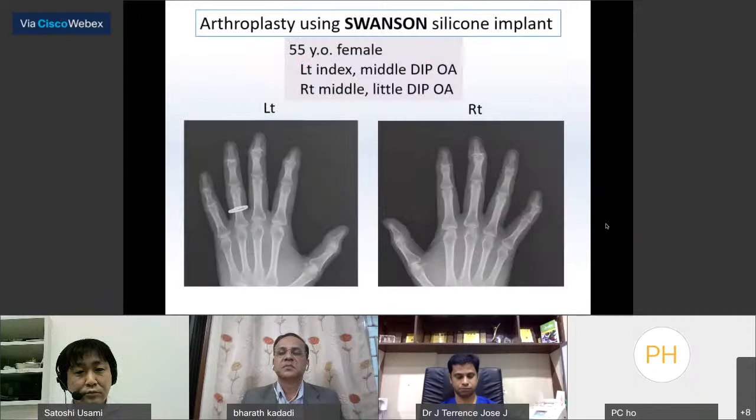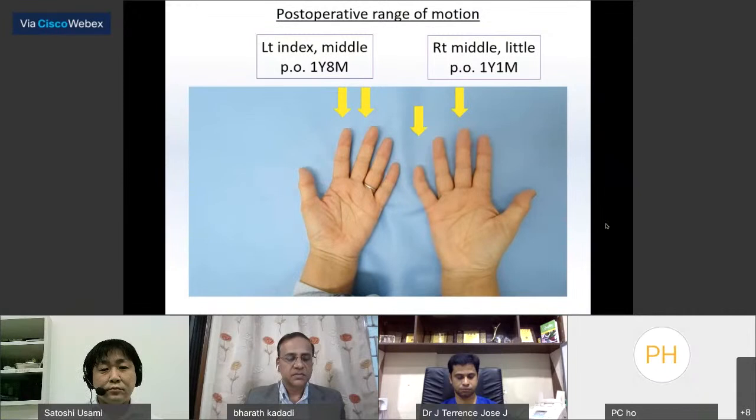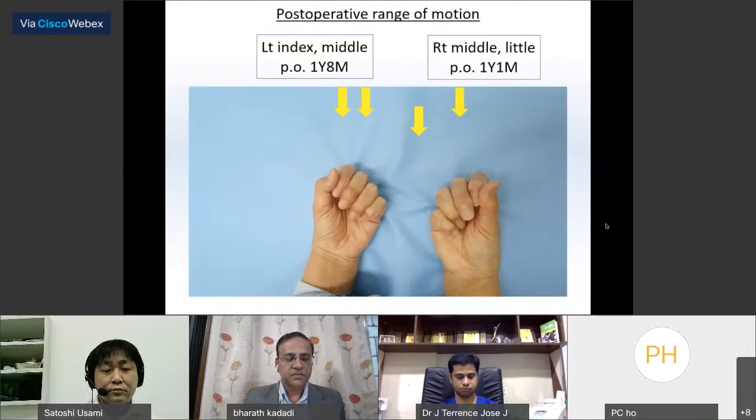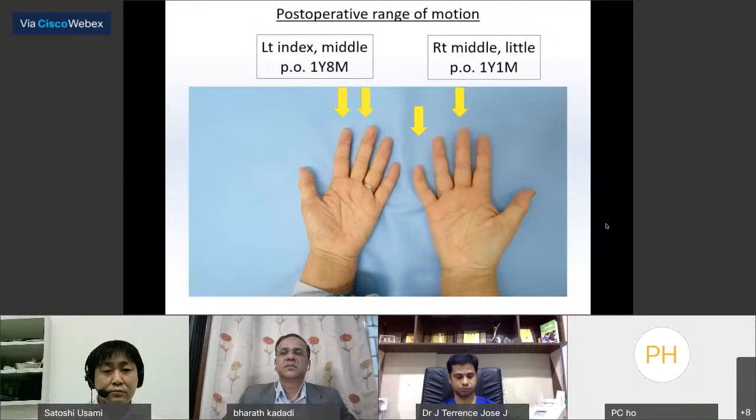The next case is a 55-year-old woman with bilateral hand DIP osteoarthritis. Finally, she underwent four fingers replacement in two surgeries. First, left index and middle joints were replaced, and she was satisfied with the result. Thereafter, she hoped to undergo arthroplasty for the right fingers at 7 months after the primary surgery. This movie is the range of motion of both hands at the most recent arrival.